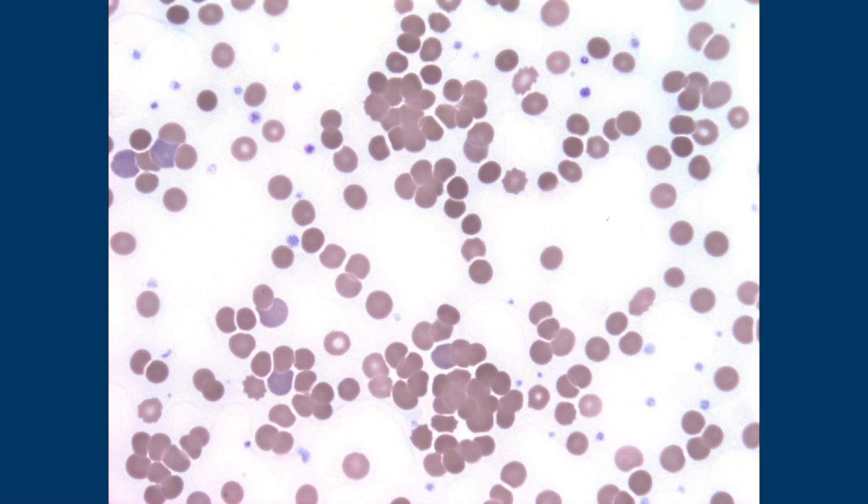I remember learning this in blood banking but it's been so long — it's antibody-mediated. When you get exposed to cold, it agglutinates like that.